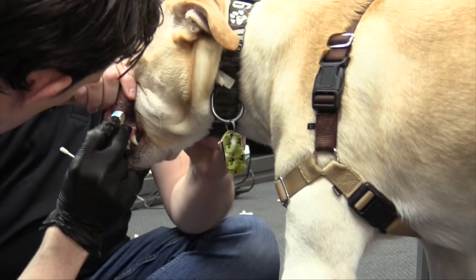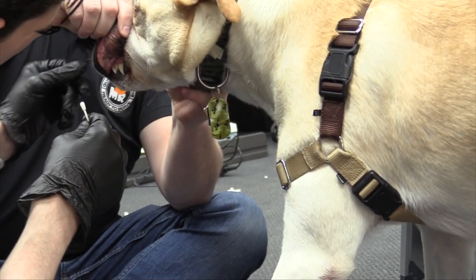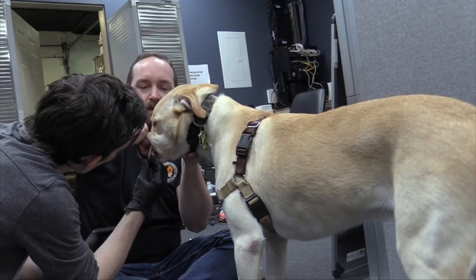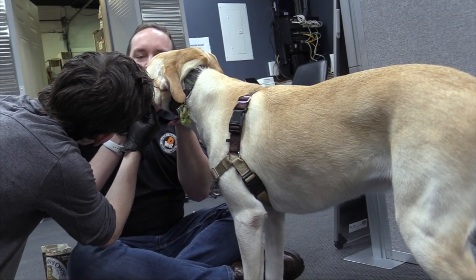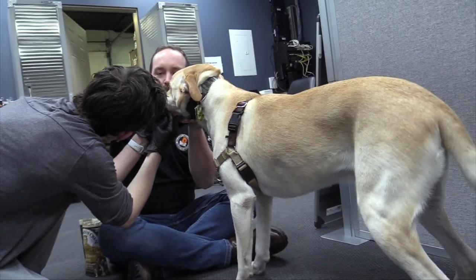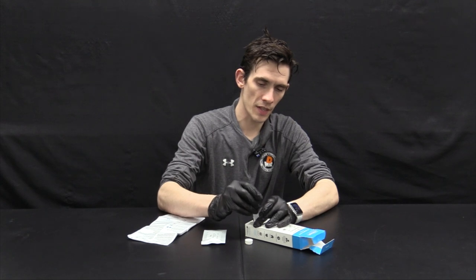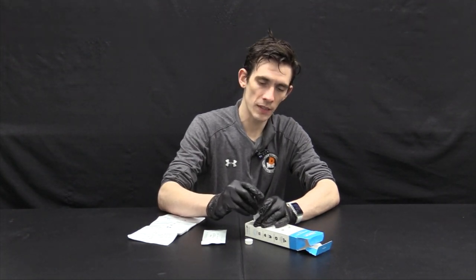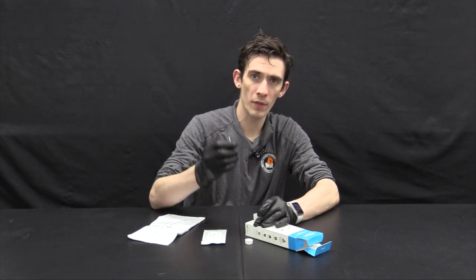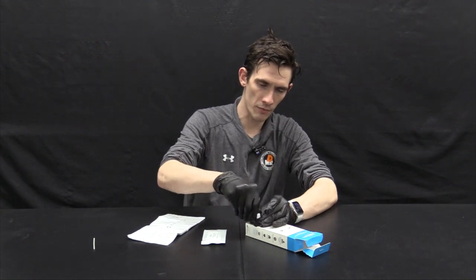After you click that lever, wait a couple of seconds. You may need to massage the area around where the lancet was placed slightly to get a drop of blood to swab the cotton swab with. Once that is accomplished, take out your buffer tube from the test kit. Insert the cotton swab into the buffer and mix it around, pressing the sides of the cotton swab against the side of the tube three to five times. Then snap off the excess cotton swab, close the lid on top, and wait for one minute.